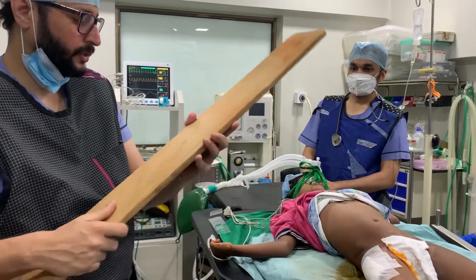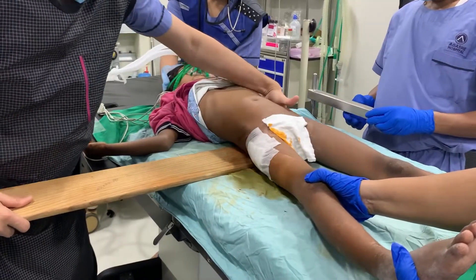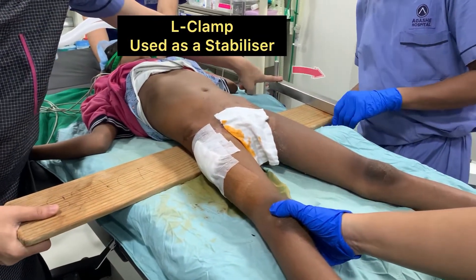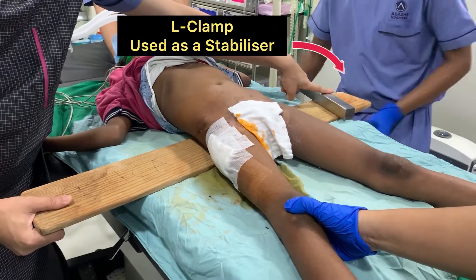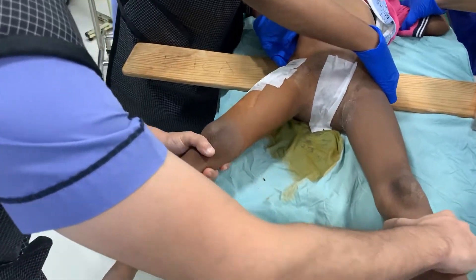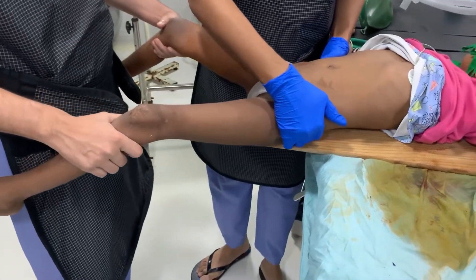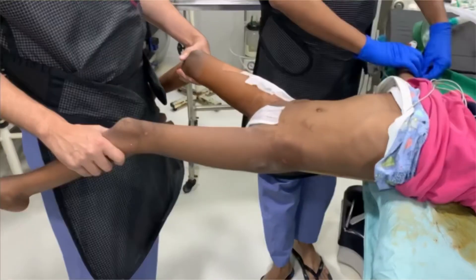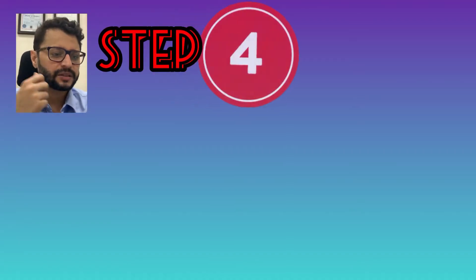For patient positioning, a wooden plank is placed under the patient's body. There is an L-clamp on the table which is required to hold the plank in place. This setup ensures the child is completely free from the posterior aspect, allowing you to easily roll plasters around it.